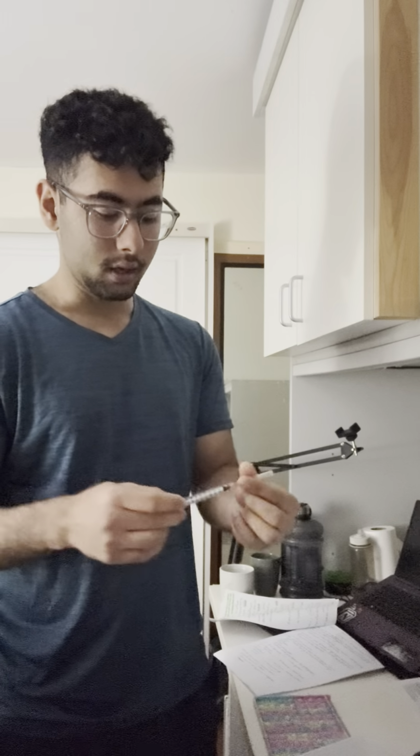I already put it there, take it out, and it goes directly in the yellow sharps container, right? But I'm going to reuse this for now because I don't have one. But don't do it in real life. Just chuck it in the sharps container.